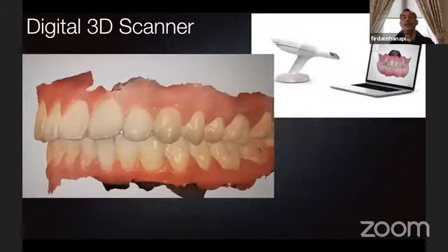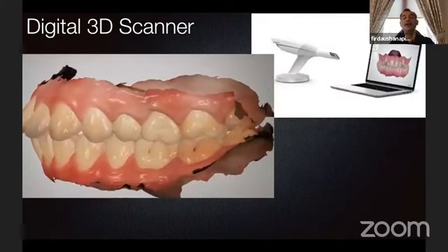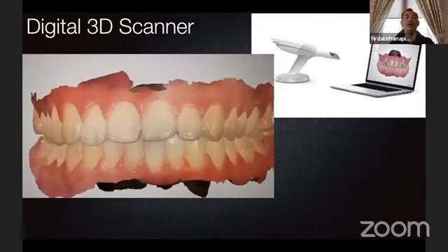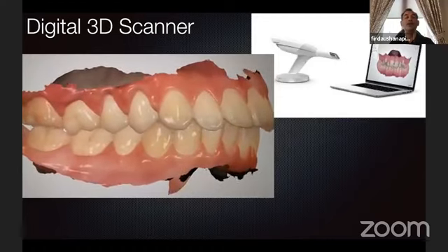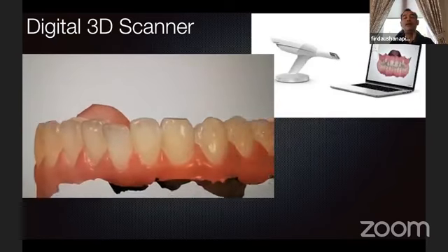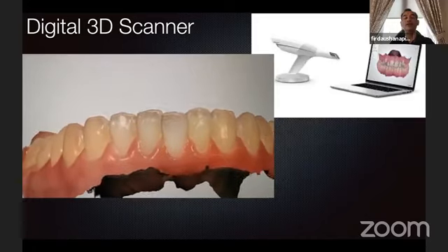We have the 3D scanners. 3D scanners are very accurate today. You can scan to an accuracy of microns. We're talking about 15 microns. What you need even for a crown bridge is between 50 to 60 micron. We can now accurately scan up to the 15 micron. So this is not too bad.